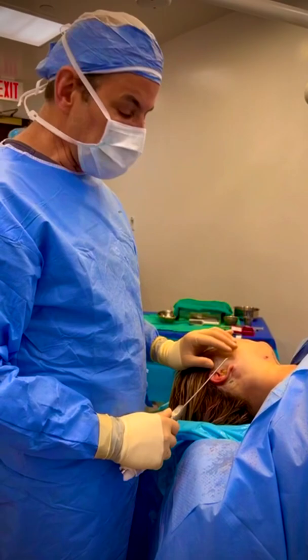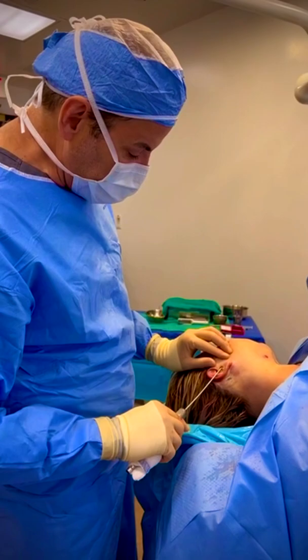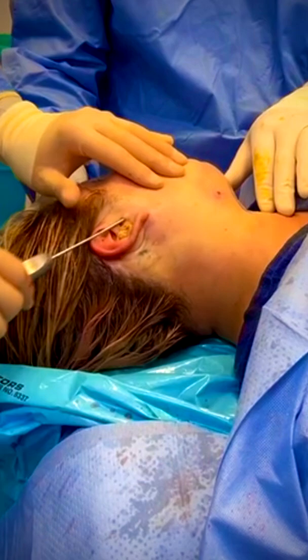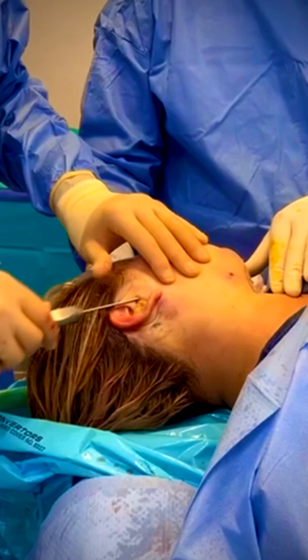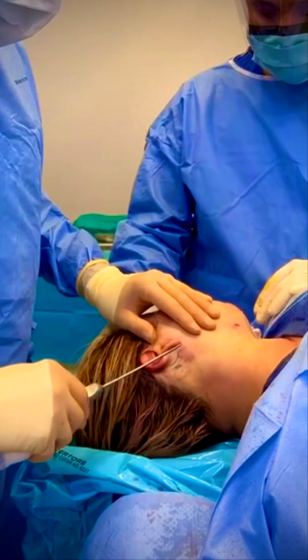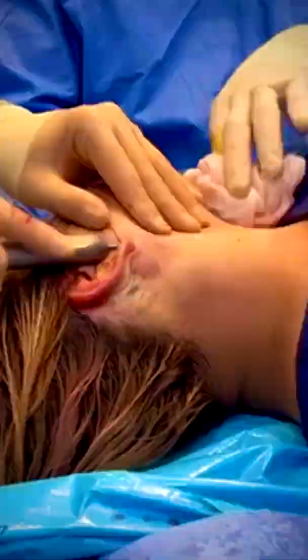So what we're doing now is called tunneling. We use this little cannula to just tunnel underneath the skin — we're going to tunnel here and then down here. This creates the space to work in for MyElevate and also for Precision TX. So everything's numb, she doesn't feel any of this. We just basically fan out the whole area — it just lifts the skin up because we're going to do all of our work in this space, using the lighted needle and thread as well as the lighted laser fiber. And then we're going to do the neck area as well. It's a real simple but essential maneuver. You can see I'm going all the way down in the neck — we're going to pass the laser fiber under there and it really improves the quality of the skin at the neck areas.